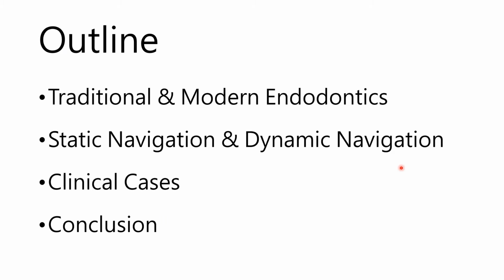And when it comes to advanced image technology, first I will explain a little bit of traditional and modern endodontics, and then we go into static navigation and dynamic navigation. And later we have the clinical case and my take-home message. And first is the traditional and modern endodontics.